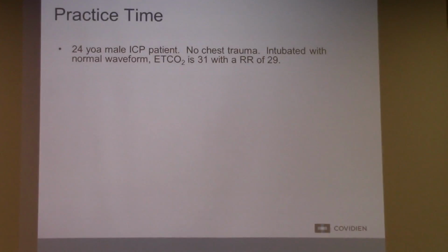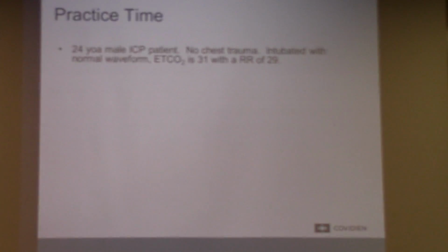What am I trying to make sure he stays between? 30 to 35. He's got signs of Cushing's. He had the Cheyne-Stokes and he had the hypertension, but he had a normal to slightly tachycardic heart rate. So he was early, so this is the perfect patient. Even as a capnography geek, it was really tough for me to not ventilate this guy.